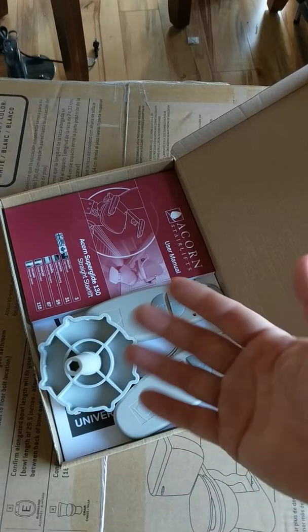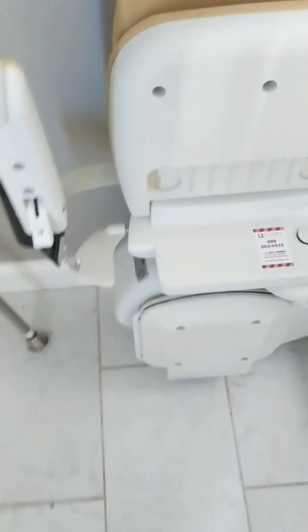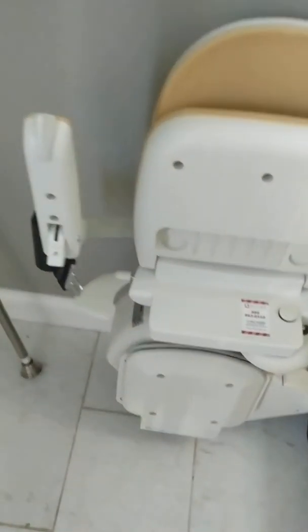You have a remote at the top of the stairs and at the bottom, in case you need to call the lift up or down. It's pretty straightforward. It's out of the way, so when you open your door — they put in a guard to stop it — but as you can see there's plenty of clearance for coming in.